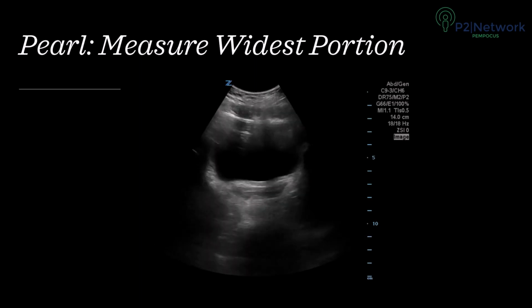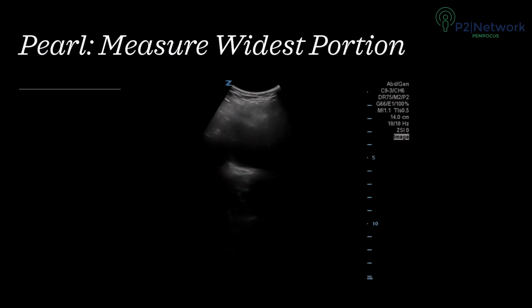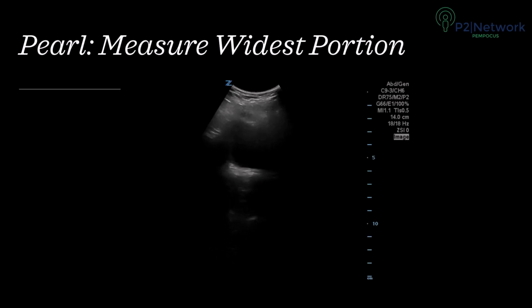Here you can see I'm slowly fanning through the bladder. At one end or the other, the bladder can look quite small, but in the middle, the width and depth are much larger. That's where I want to take my bladder volume measurements.